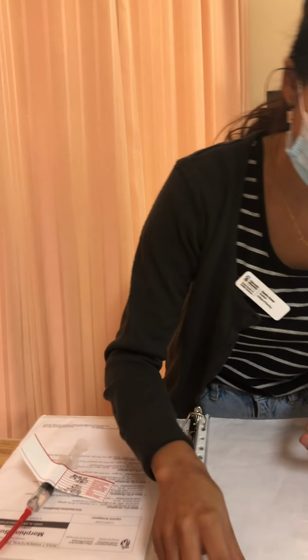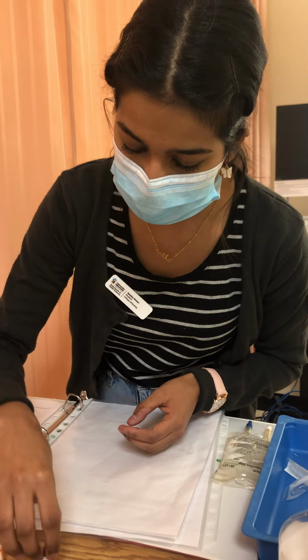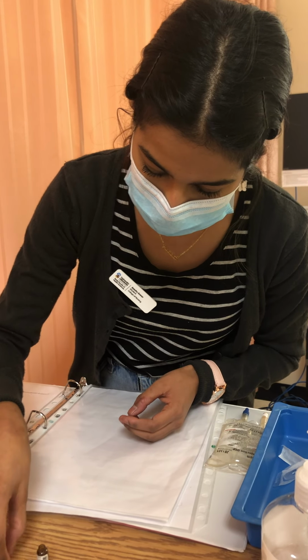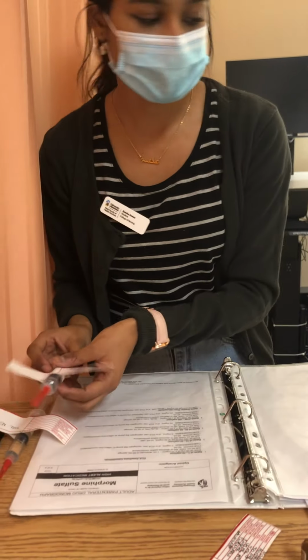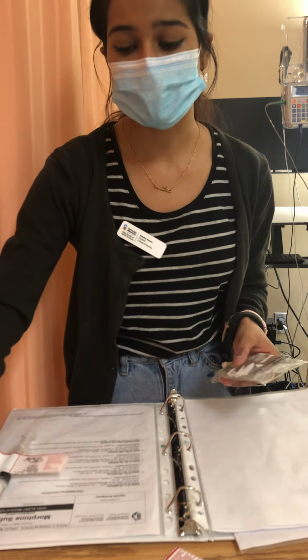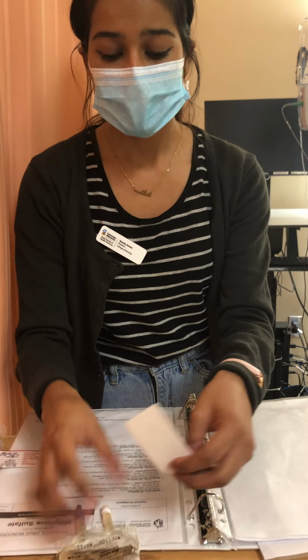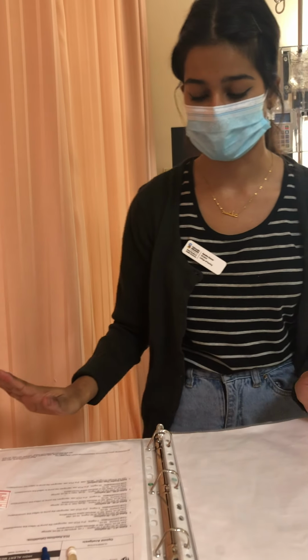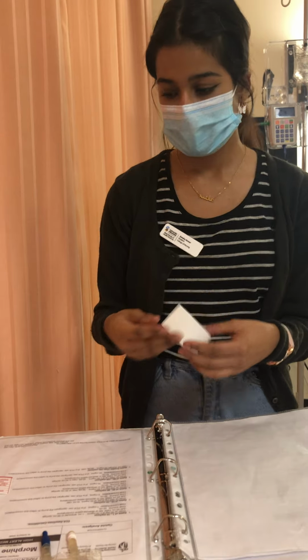The concentration of this was 10 milligrams per ml. So I'm going to look at the concentration: 10 milligrams per ml. So we have the right concentration. We're going to be mixing it with 45 mils of normal saline, which I have over here because I drew up 5 mils of normal saline in the syringe, which I will put in the med waste. So I have done my second check, so I can get a nurse to do an independent check to make sure I have all the right medication. A nurse has done the second check, so now I can go ahead and inject my medication.